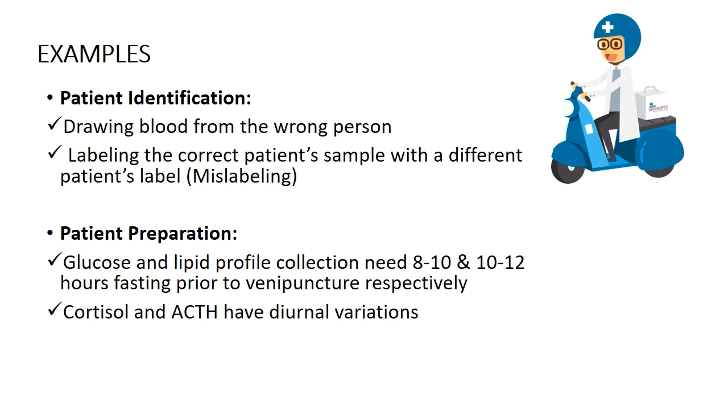So what is happening is that the phlebotomist is not verifying the identity of the patient. So it is very, very important to verify the identity of the patient. Just imagine that in a reception there are 3-4 patients standing, everybody is in a hurry, and there is only one receptionist. During billing, maybe one patient is asking for HBsAg, HIV, whatever, but by mistake the billing was done differently.